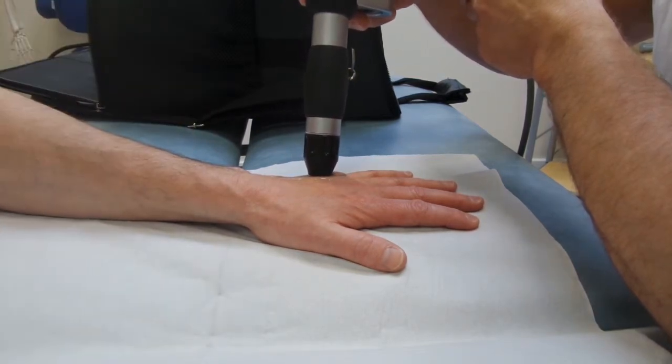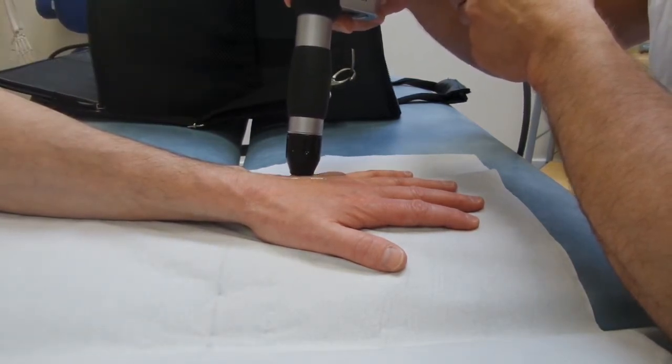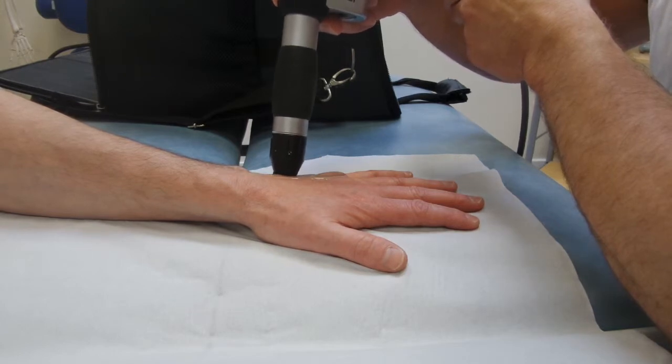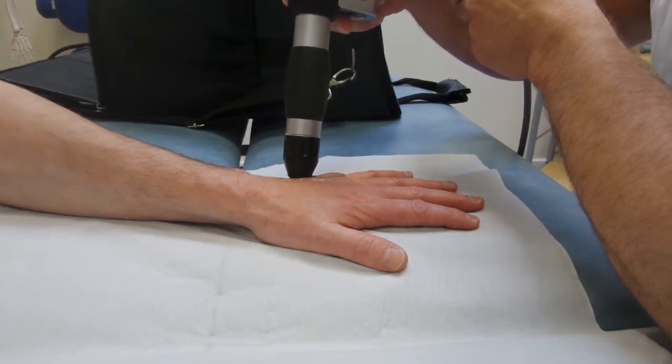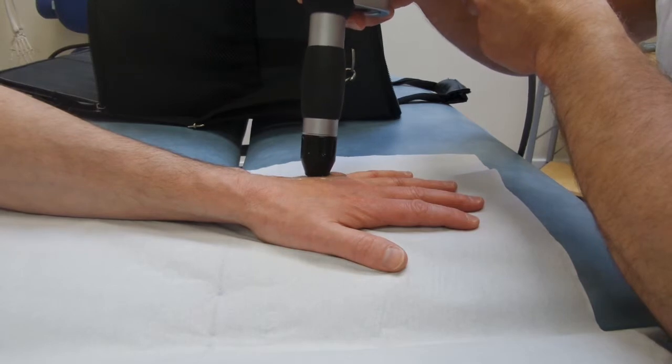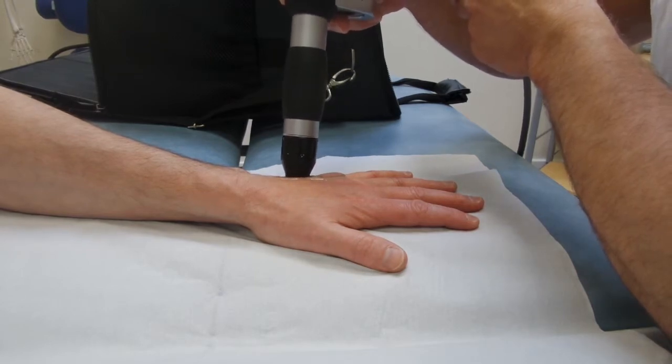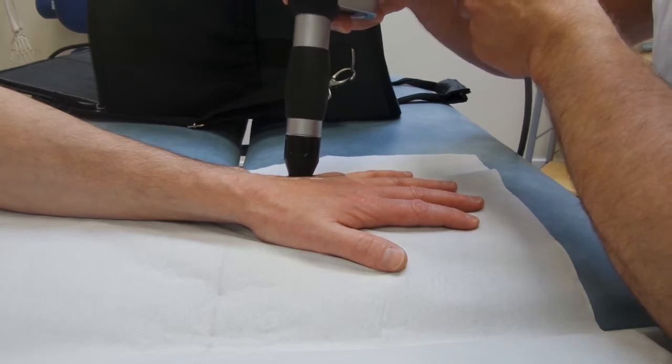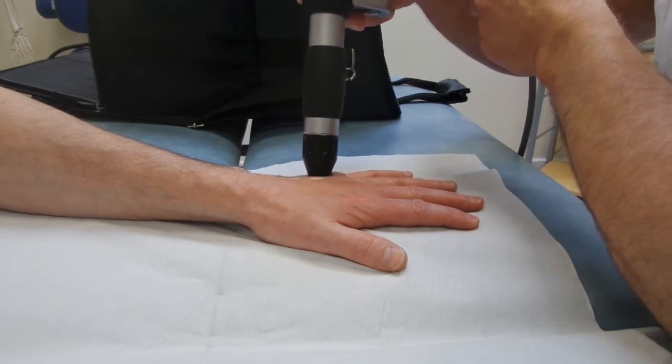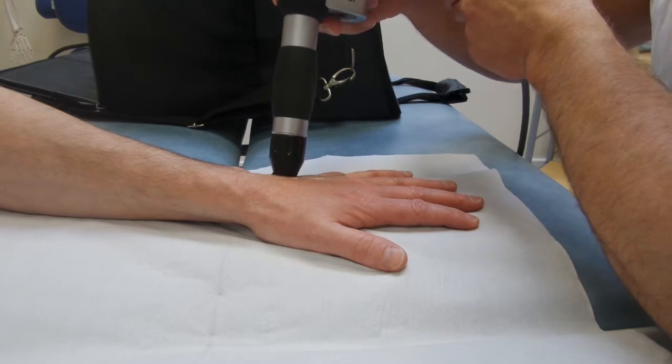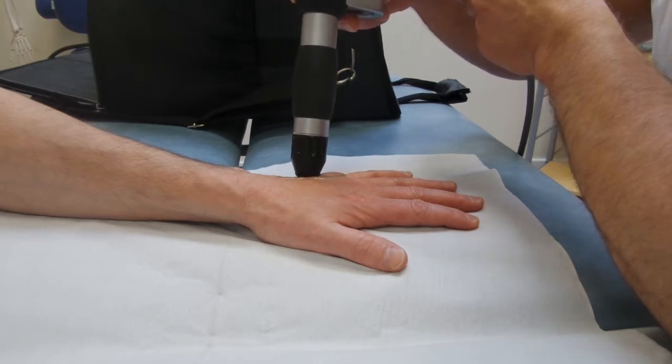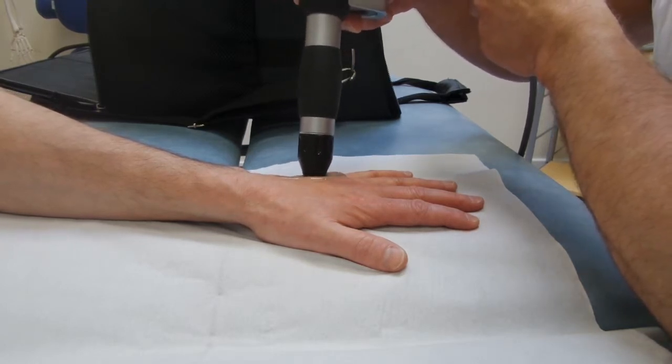The patient is offering feedback about how the shockwave is reverberating up the arm. We try and concentrate on the worst areas as much as we dare. Obviously we don't want the patient passing out or vomiting during the treatment, and so we just take our time, move up and down the gutter, and put the shockwave through the area.